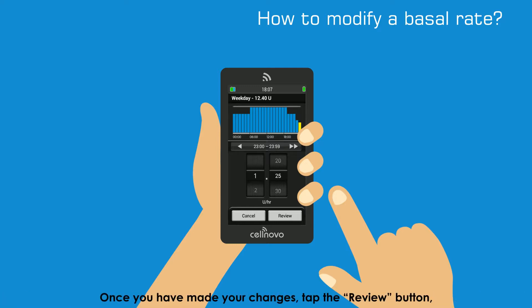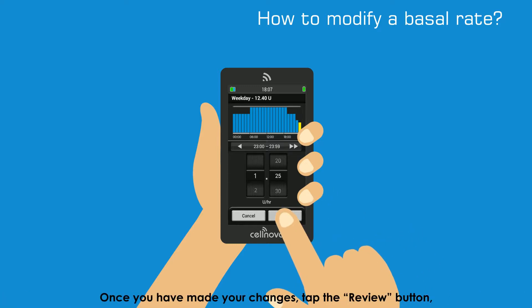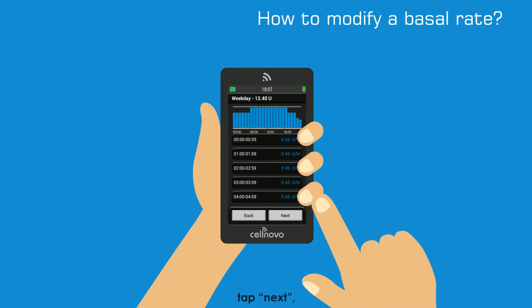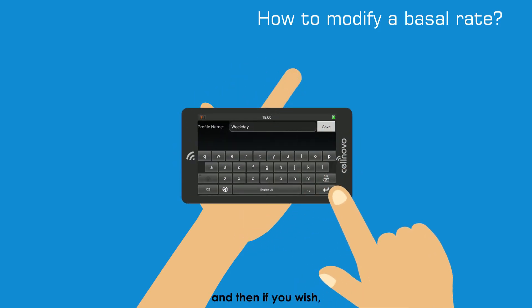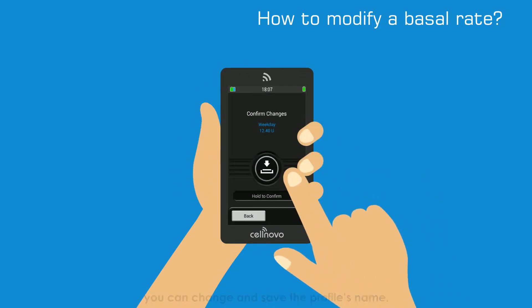Once you have made your changes, tap the Review button, tap Next and then if you wish, you can change and save the profile's name.